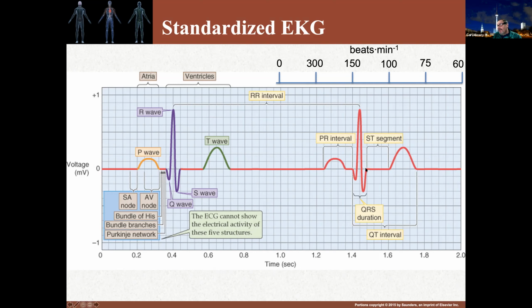We then have an area at the end of the S wave before the beginning of the T wave that we call the ST segment. And this measures the time between the end of the S wave and the start of the T wave.